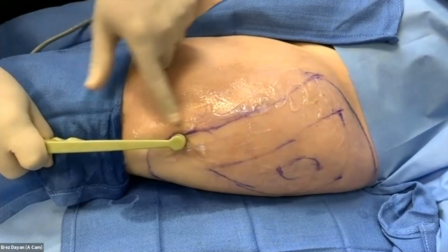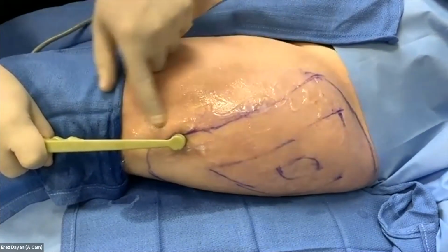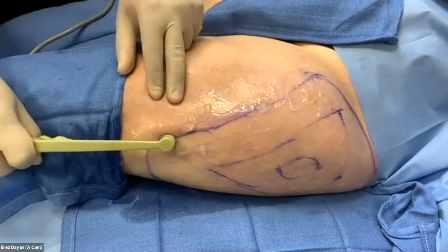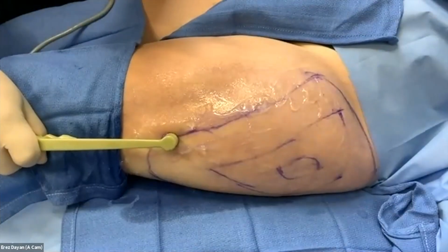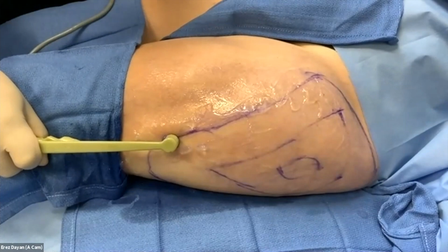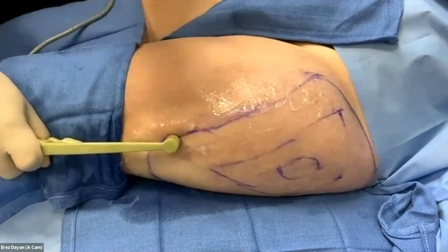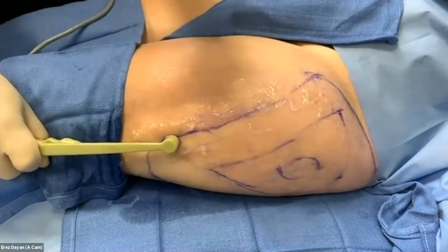Now, part of the reason for that is because I put a little less tumescent here than up here. You can see how this is fuller than here. So the less tumescent you put in, the faster you'll reach target temperature. And as we reach target temperature, there's two kinds of fast beeps. There's a fast triple beep, like you're hearing now, and there's a slower one that goes dum dum dum dum dum, and I'll show you that. So the fast one indicates internal target temperature was reached, bless you, and then the external target temperature is the slower triple beep.